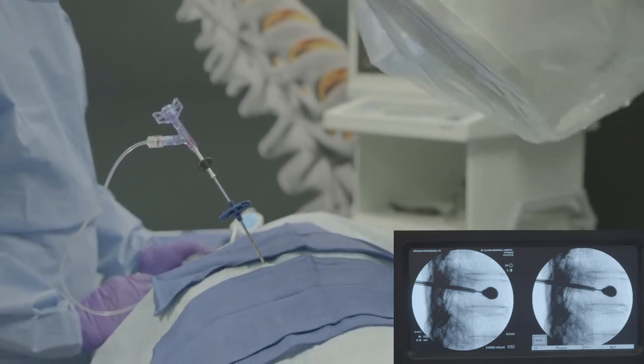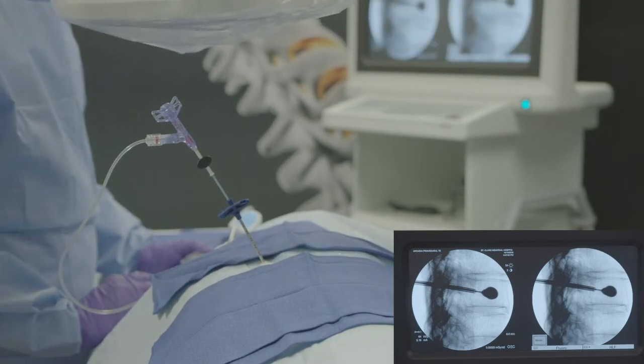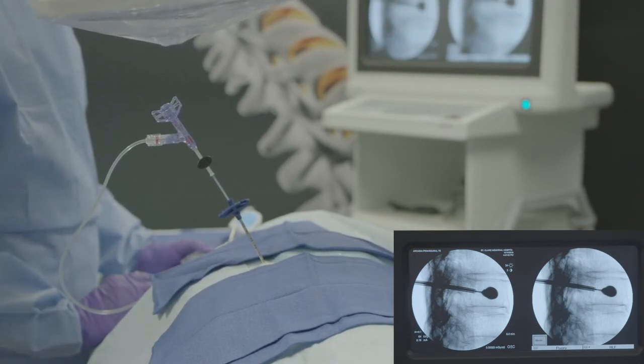Increase the volume in small increments. Assess balloon position in lateral and AP views before proceeding to further volume increase.